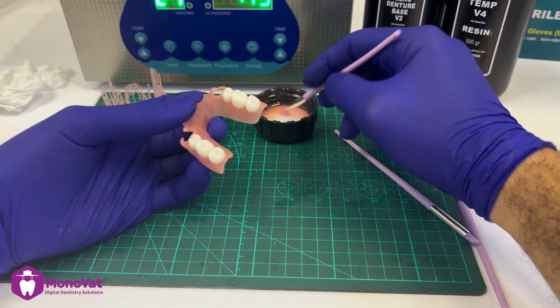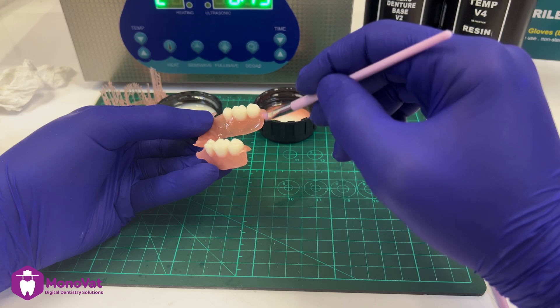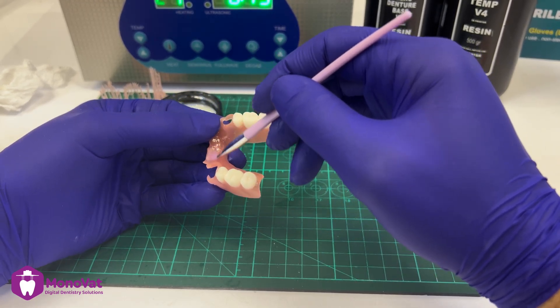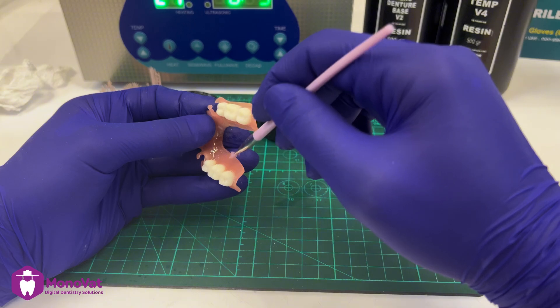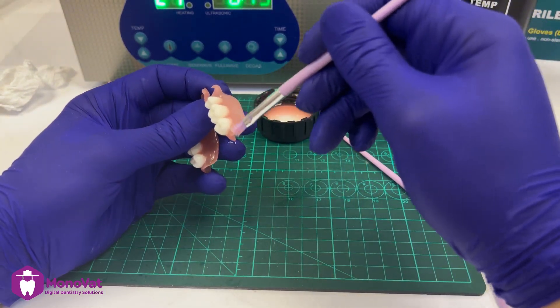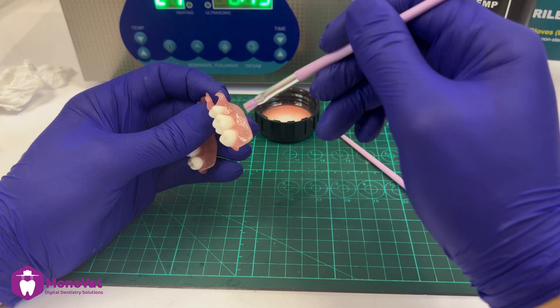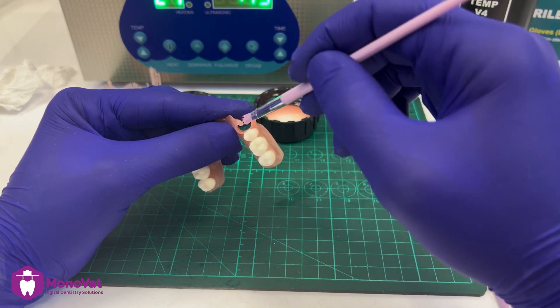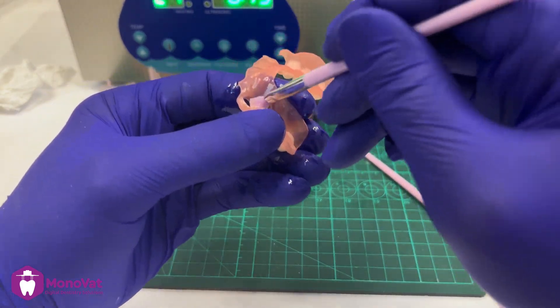Now we are starting the candy coat process. This means we cover the entire denture on all sides with a layer of the same denture resin. I coat the outside with a good thickness layer, but on the inside of the denture I use a very thin layer to avoid any fitting or occlusion problems.